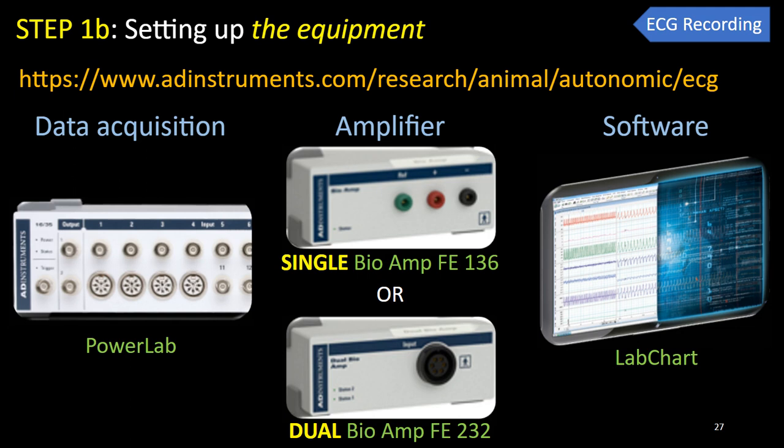Our lab uses the ADI system to record ECG. We found this high-performance system reliable, the noise reasonably filtered, and the tiny voltage signals of fish hearts acceptably, if not beautifully, optimized. Moreover, for us, it's economical because we use the same system for our rodent and rabbit models. Whatever your cup of tea, an ECG recording system requires 3 basic components.